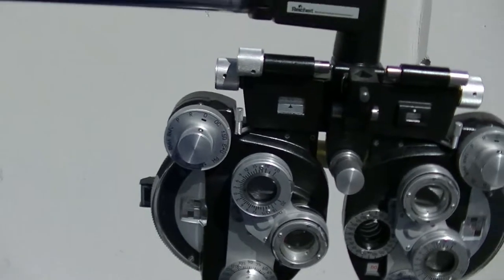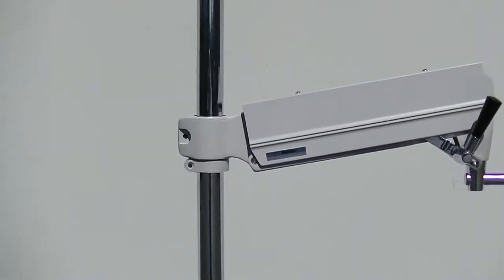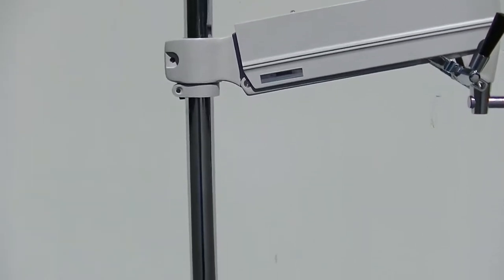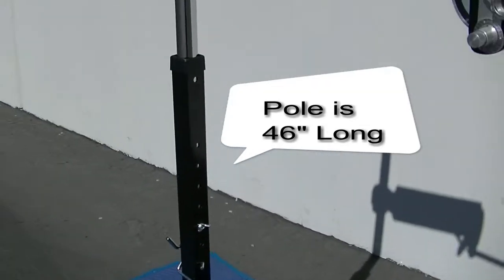The unit is very stable. The reason it's so stable is, as we come down the stand, this is a Reliance pole — a regular Reliance stand pole that goes inside this 2x2 metal square support.